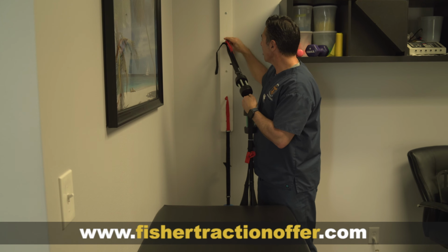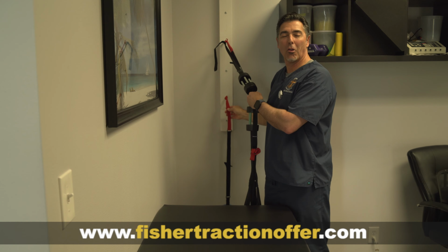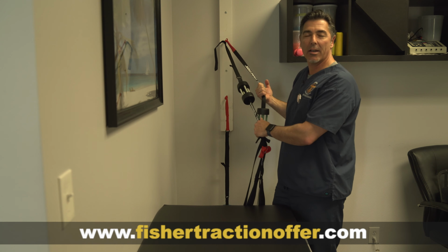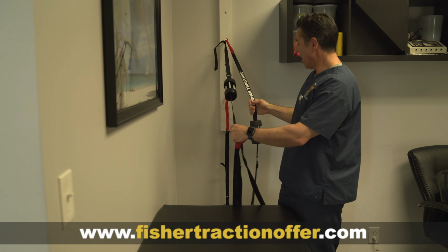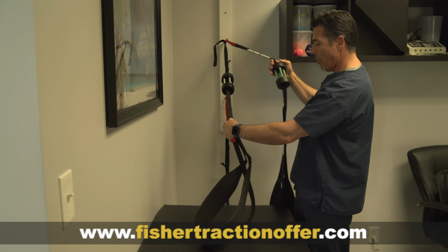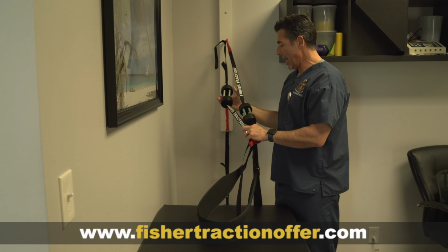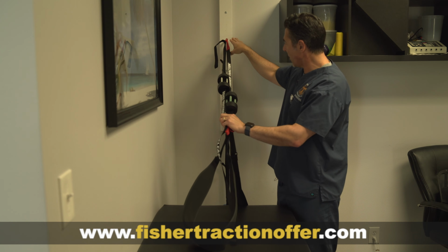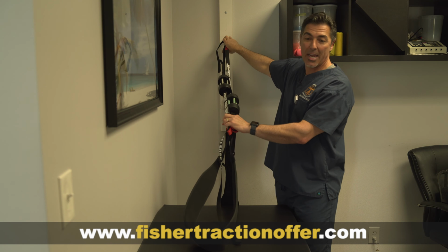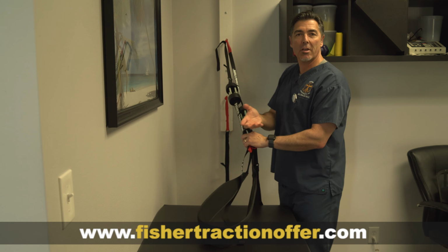I put these eyelets on here where I could change the angle of pull for any of the tractions that I wanted to apply to my patients based upon the level of injury. With this one, I have both of our low back units attached at the same level, because this angle is about equivalent to where a doorknob would be if you're laying on the ground, which gives us about a 35-degree angle, which hits the majority of the low back.